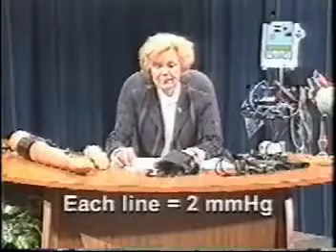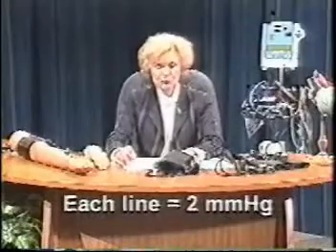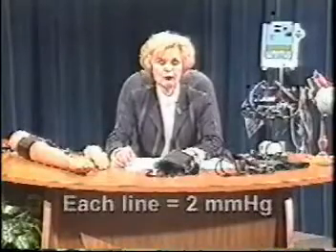There are other styles of gauges as well, but suffice it to say they all basically work the same way. They just may be in a little bit different shape. Each line on the gauge measures 2 millimeters of mercury.